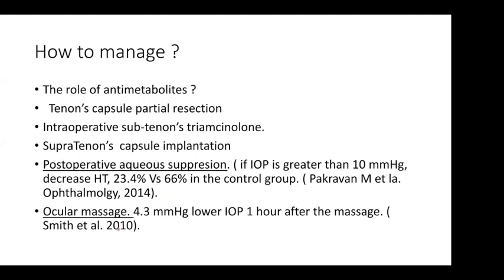The other good point is the ocular massage. We found that when you do an ocular massage, you can push the aqueous, and that aqueous could have some mechanical effect on this periplate fibrosis.